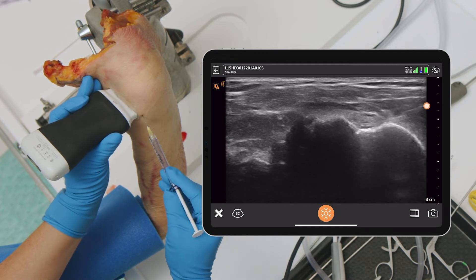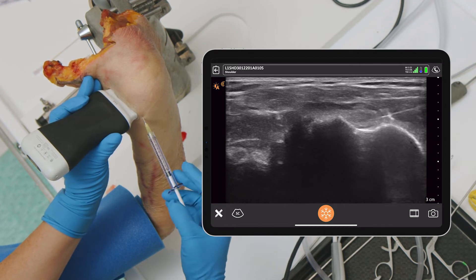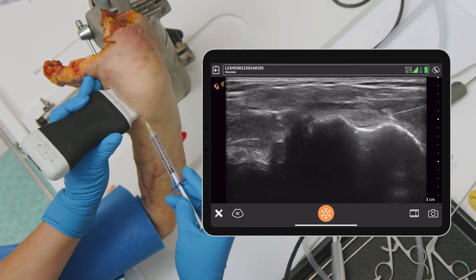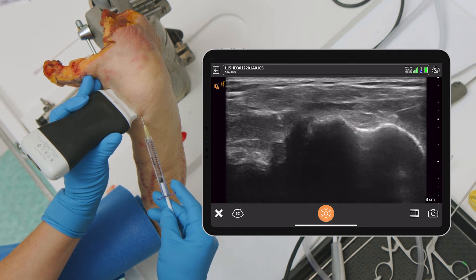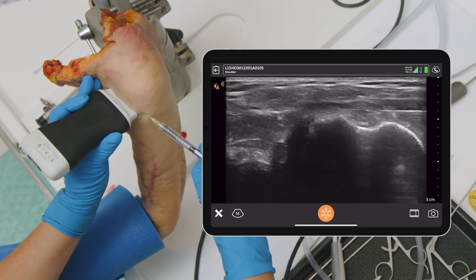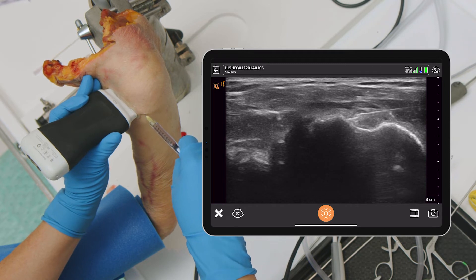There we go — there's the needle there, and it can either come in from this side right there. You can see I'm into the sheath right there. See the needle in the sheath, below and posterior to the tendon. You can also actually move it and come to the other side if you wanted to. So that's the other thing you can do — come to the other side of the tendon.